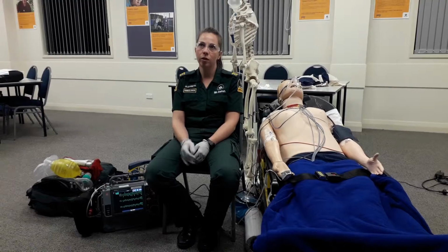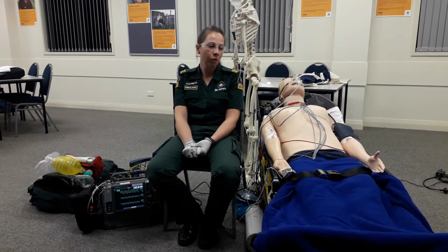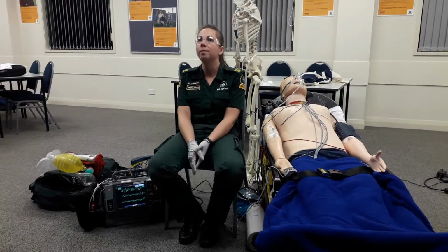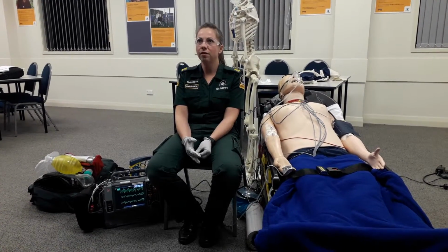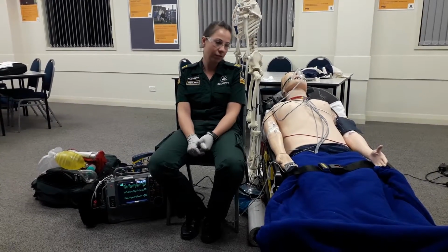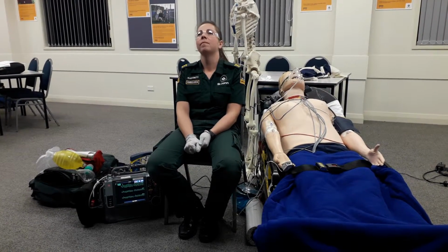The vitals that we've gained from this patient are a heart rate of 170 with a 12 lead showing a wide complex ventricular tachycardia, as we can see on the monitor. His blood pressure is hypotensive at 70 on 40. His resps are 24. He's short of breath. His blood sugar is 7.6 and his temperature is 37.